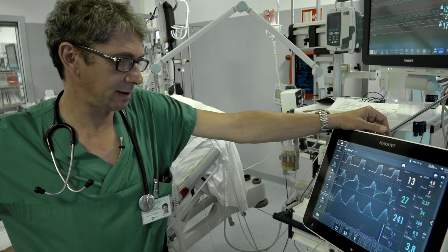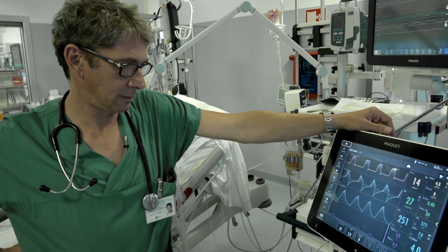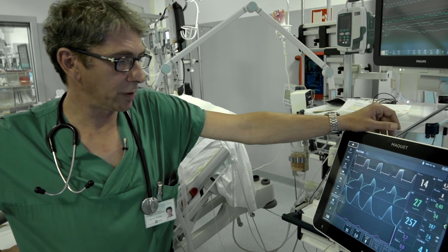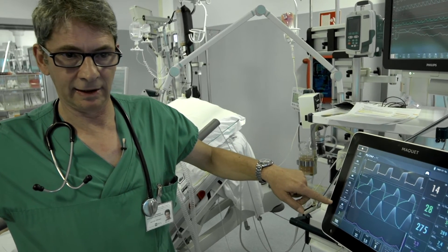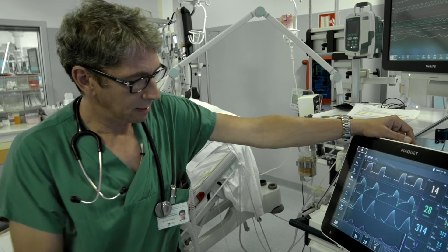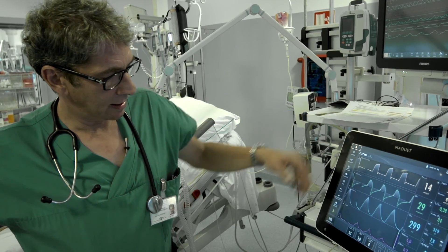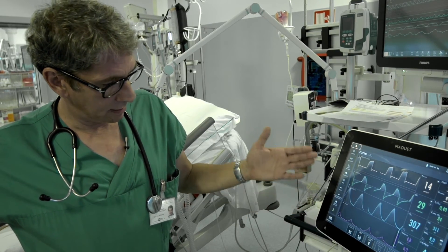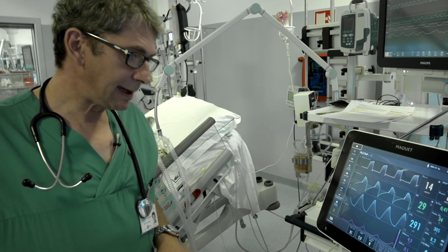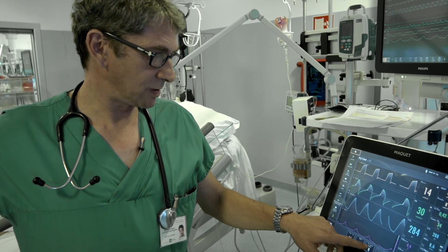Let's wait a few seconds. It's very important not to resize the EDI scale, because otherwise you can't appreciate the variation. As you can see, the diaphragm is starting to work. We don't have any effective effort on the flow curve, and diaphragm EDI activity is still low. Maybe I can go down a little bit more with pressure support.